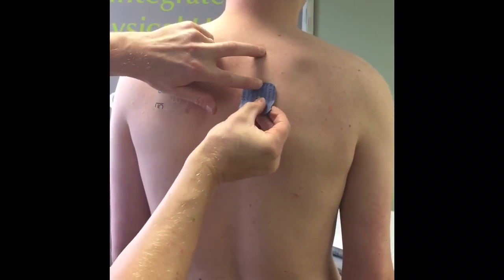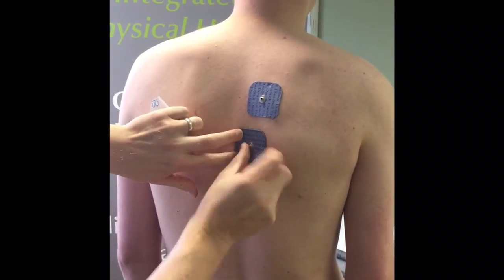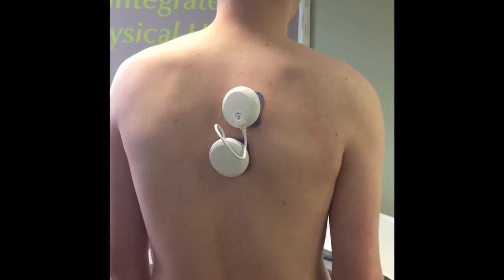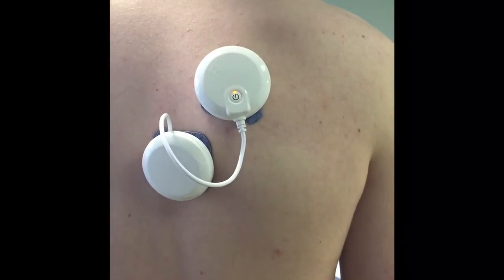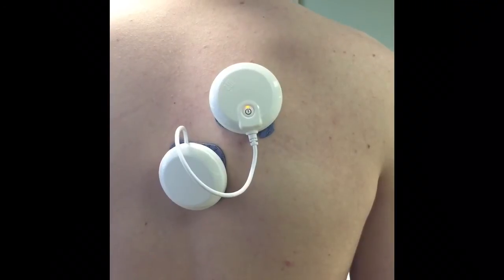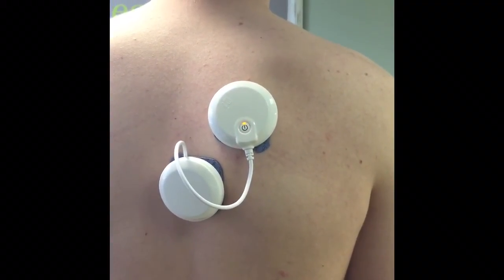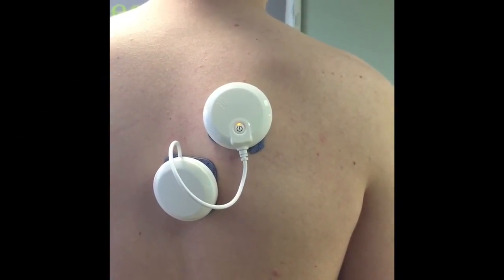So we can place these conductors across the muscle that we want to work, clip on our wireless machine, and turn it on. First of all, the machine will scan Joe's muscle to find out what frequency it's working at. You'll see the muscle periodically twitching and then resting as the machine works out what's going on. Then we will show you how the machine can be integrated into Joe's rehab and improve the strength of that muscle.